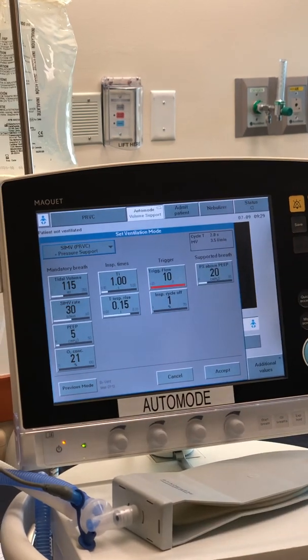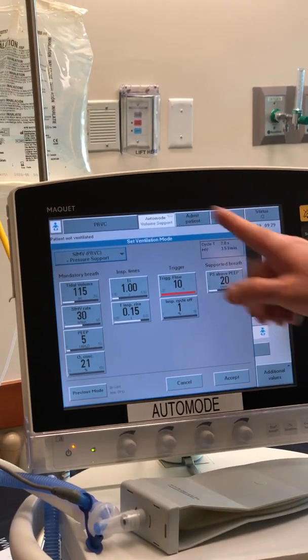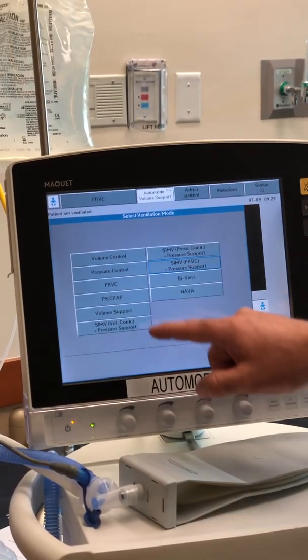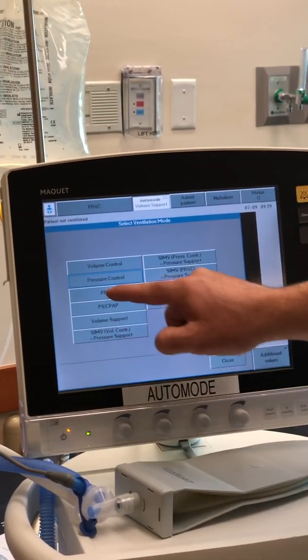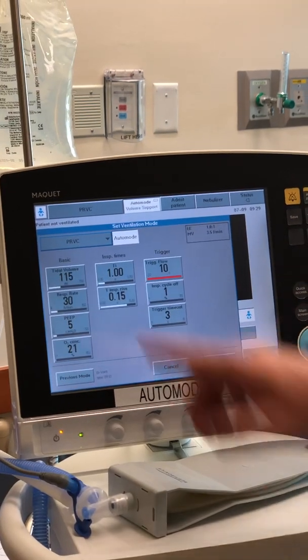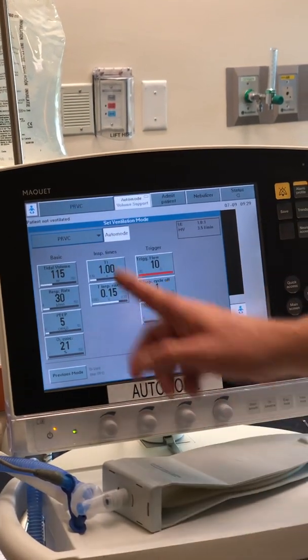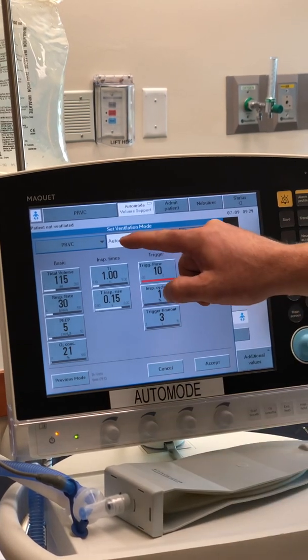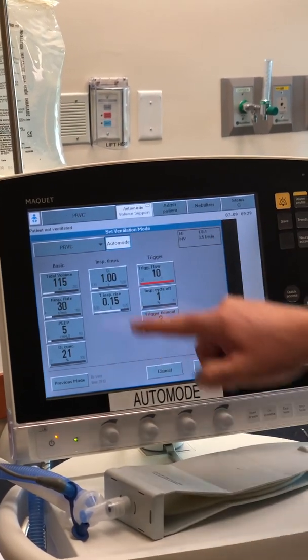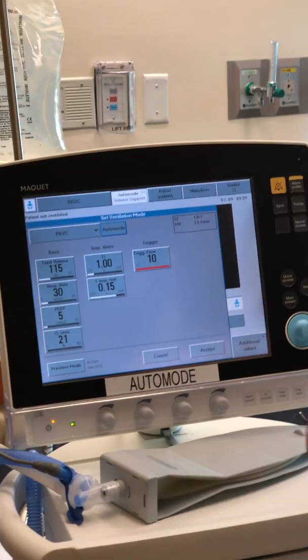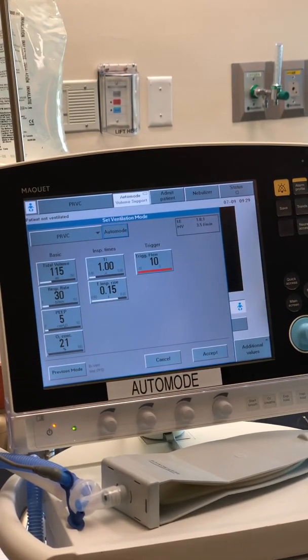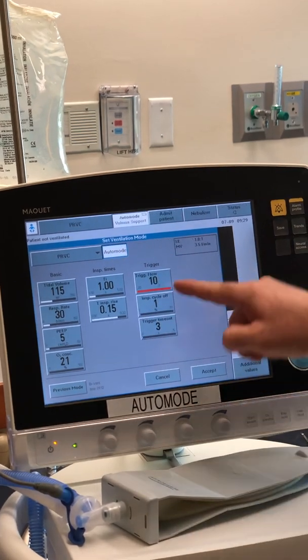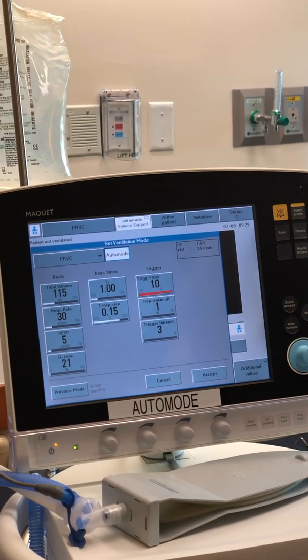There's no auto mode tab available in SIMV PRVC because there's a pressure support available — that's telling you this can't be an auto mode. The only way auto mode is available is in the assist control modes. PRVC assist control has an auto mode tab, and you have to hit it to activate it. Hitting the tab again gives you those functions — now it's PRVC auto mode.